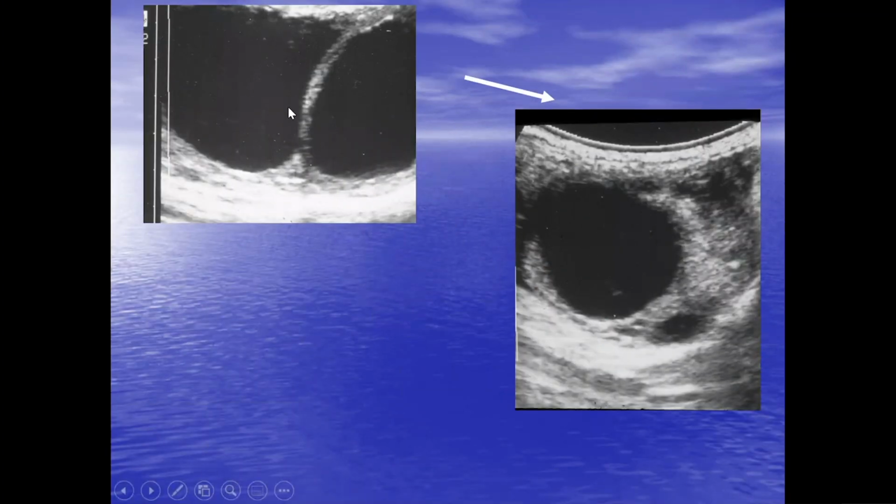This is a mare with 2 follicles. I just picked it to help illustrate it. So 2 pre-ovulatory follicles up in that image. The next day, one of them had remained, one had ovulated.